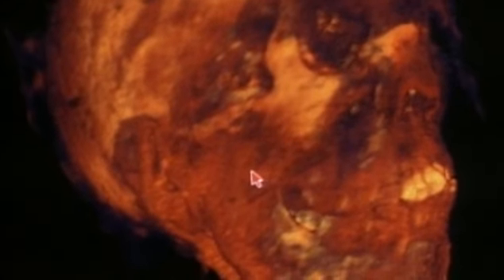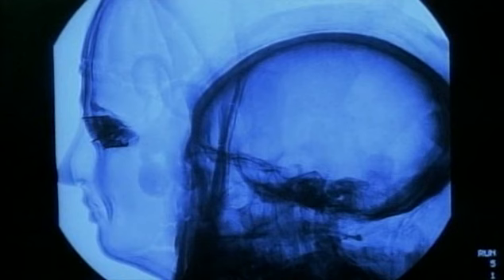The realm of virtual reality is entered through a graphic 3-dimensional image of a mummy's skull. For the first time, CAT scans like this allow physicians to explore the inner landscape of the ear in detail and plot their procedures before surgery. This kind of data cannot be just taken from existing scans on patients, because the amount of radiation involved to produce such good quality images would have meant a very large dose of radiation.